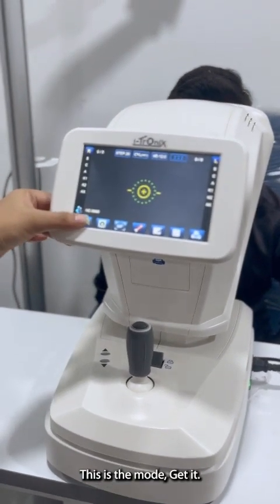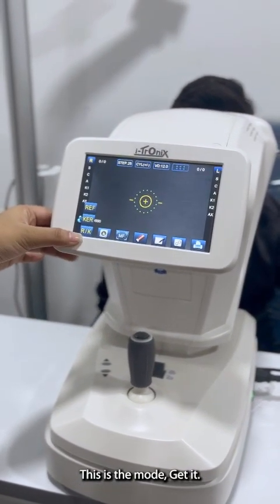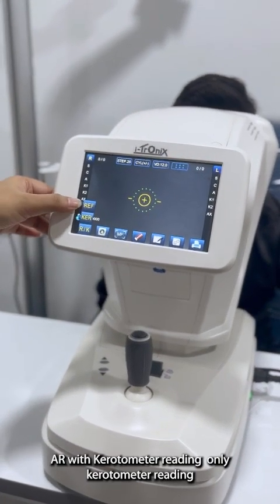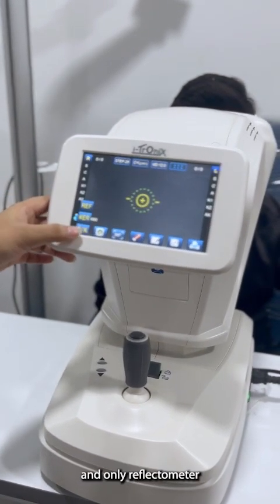This is the mode we get: AR with keratometer reading, only keratometer reading, and only refractometer reading.